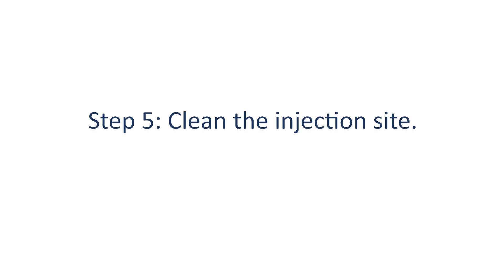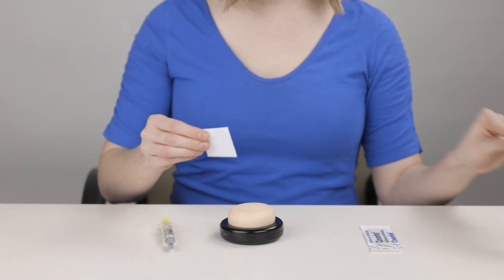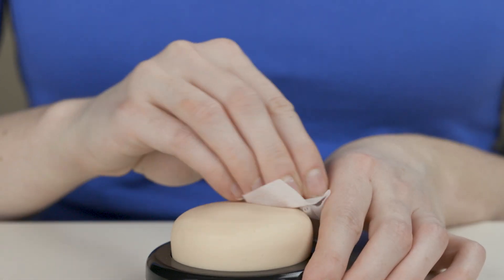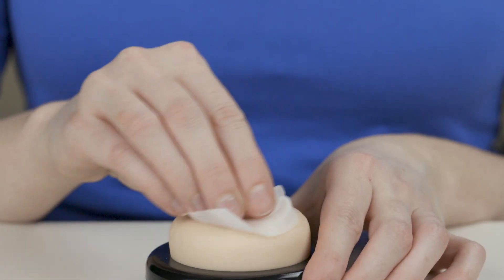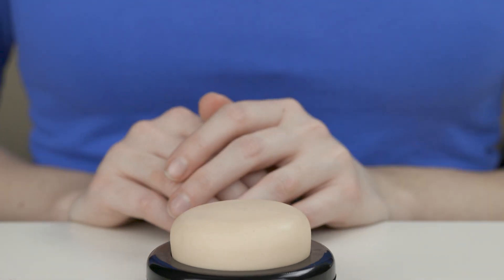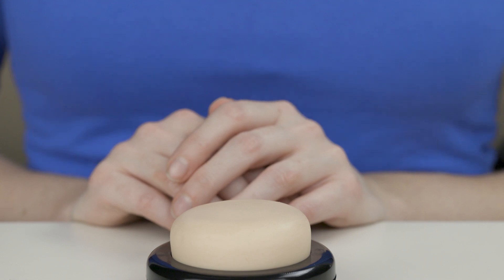Step 5: Clean the injection site. Open the alcohol wipe and clean the injection site with the wipe. Wait a few seconds to allow your skin to air dry. Don't touch or blow on your skin.